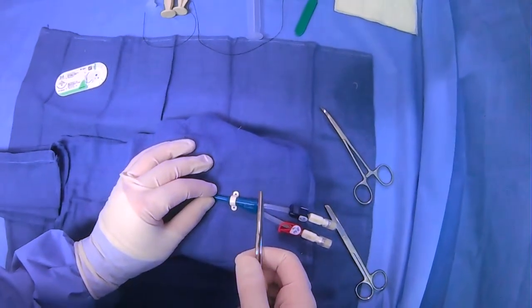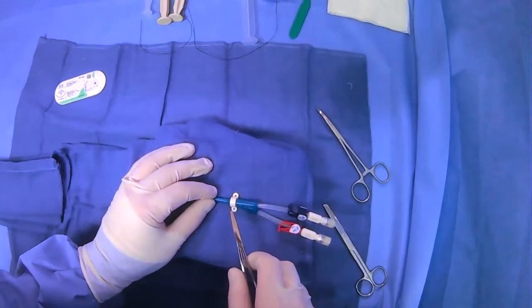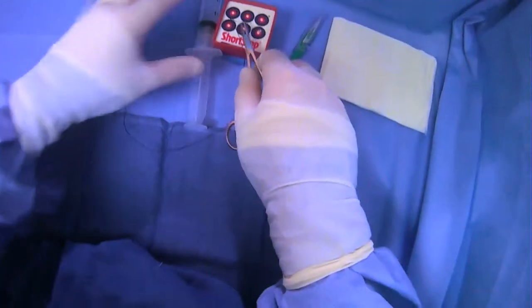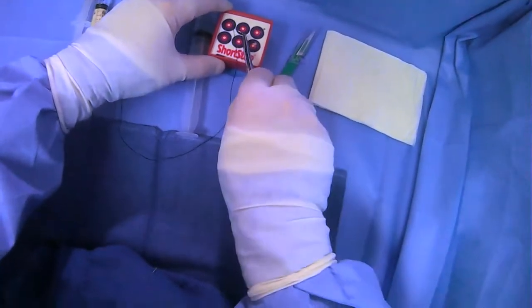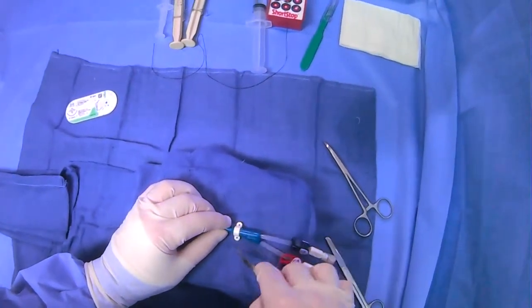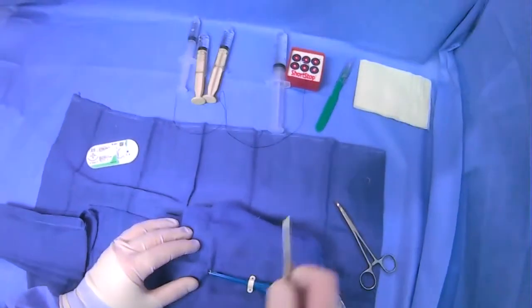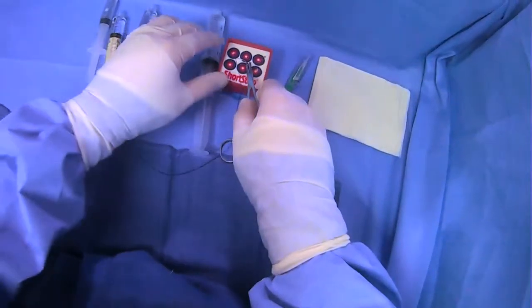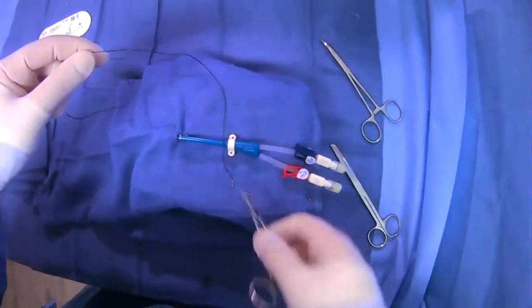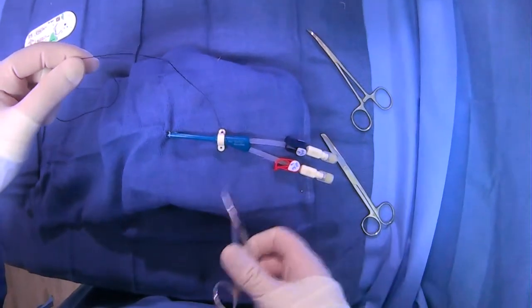For this particular technique you can use something like 2-0 Ethylon, which I have here. Prior to grabbing your suture, you can give some more lidocaine in this area because it's not numb like the tunneled area that we've been working in before.